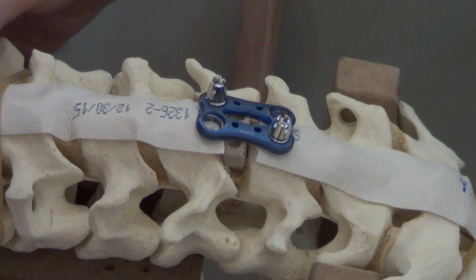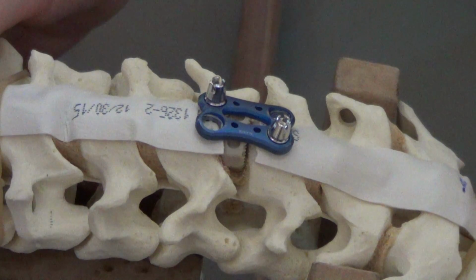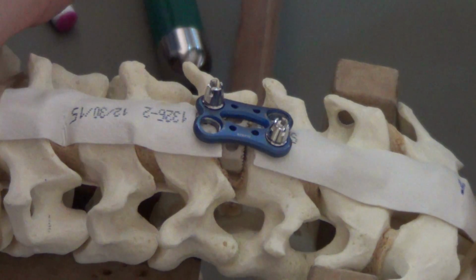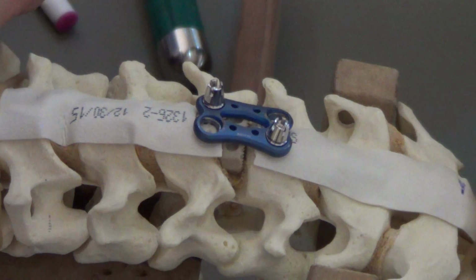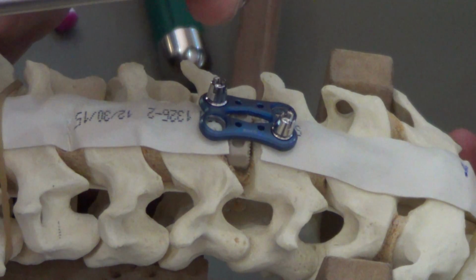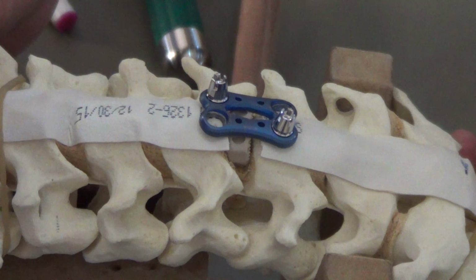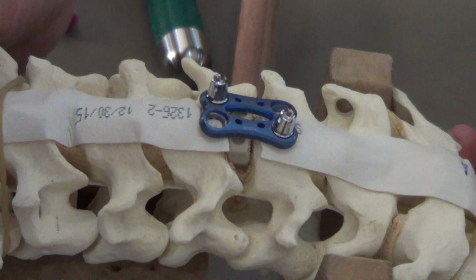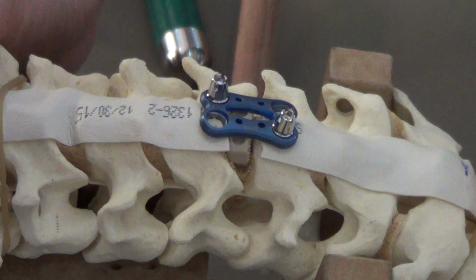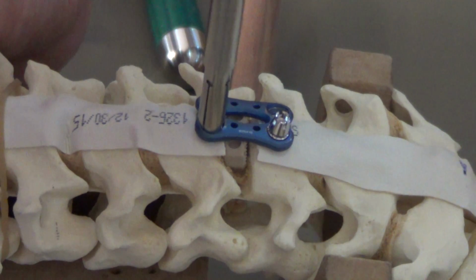Nowadays, usually previously we have to make a hole with a drill. You see, if you have a hole set, you will have to use a drill set to make a hole. And of course, if you have this drill set, remember that you adjust the drill so that it is not more than 16 millimeters. So the size of the screw that you are using, just use it. Or in fact, I usually use it even less, about 14 millimeters, so that the screw itself, the next 2 millimeters, will find the purchase. So if you have the old set, you just drill it in the direction that is in the bone.